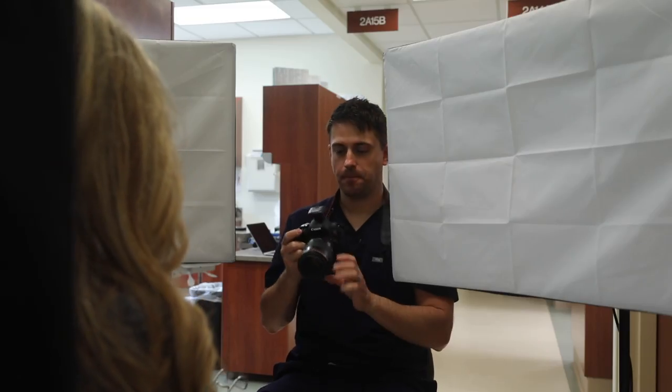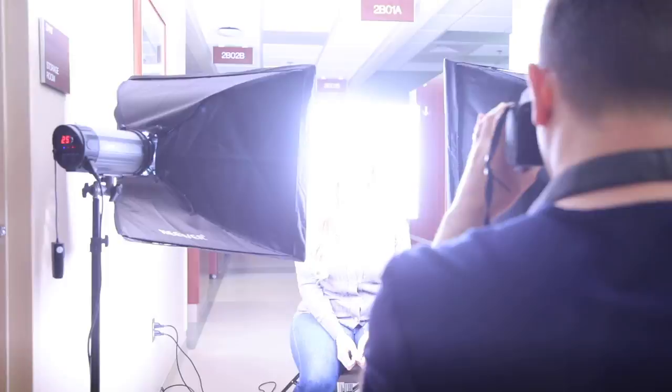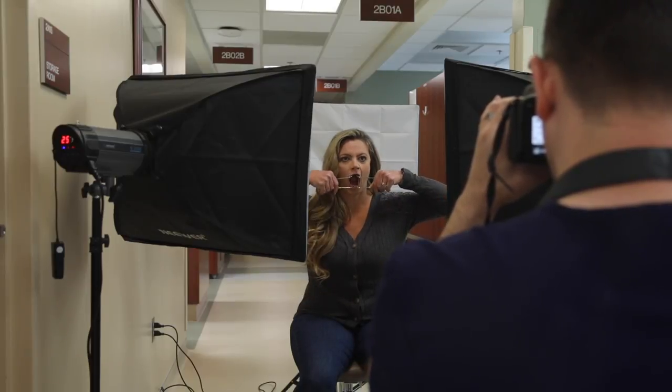I then position myself in front of the patient, sitting at the same level as the patient's head. You can take these photos in any order you like. Because I use digital software to sometimes treatment plan, I typically try to make sure that the patient's head does not move much at all when transitioning from the smile to the retracted photograph.